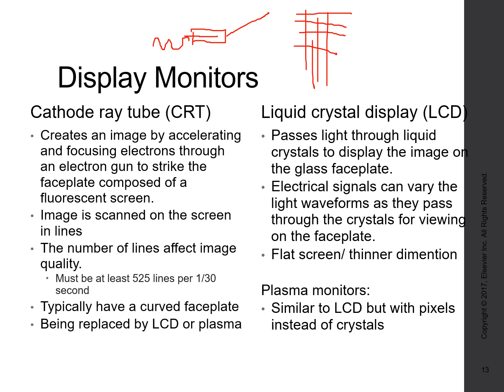Since then, we've pretty much transitioned to liquid crystal displays or plasma displays. While we still have to cover our cathode ray tubes, again, I'm going to talk about them more extensively in our fluoro unit. So for today, we're mostly going to be concentrating on our liquid crystal displays or our plasma monitors.